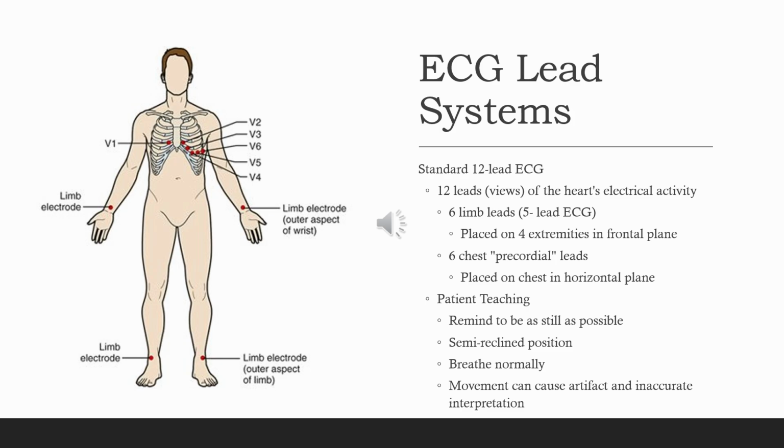A 12-lead ECG is such an important tool to be able to diagnose conditions like a myocardial infarction, myocardial ischemia, electrolyte imbalances, and different conduction abnormalities. So mastering proper lead placement and patient preparation will help you to obtain a clear, reliable result, which is needed for timely diagnosis and for treatment.